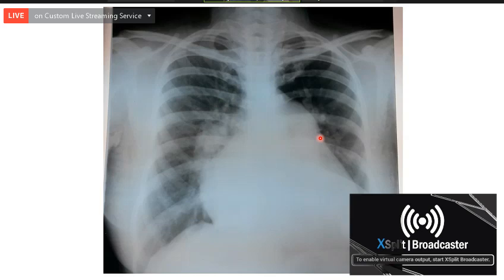Okay, in this patient, what do you think? Are there end on vessels, or is there cutting off of the blood supply with centralization of pulmonary arteries? What is happening? How will you assess? What are the points by which you decide about the pulmonary blood flow?